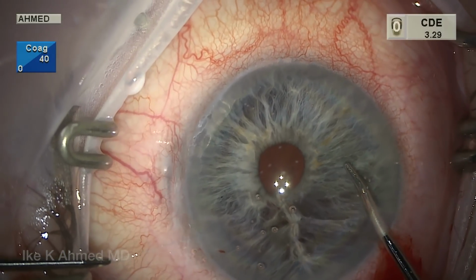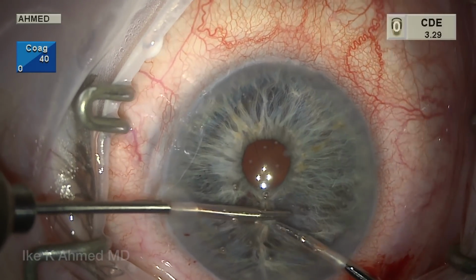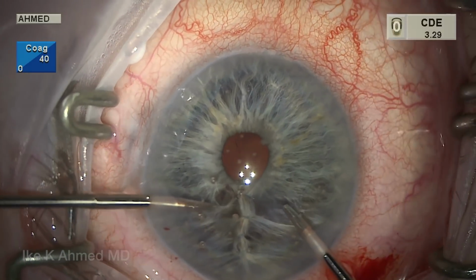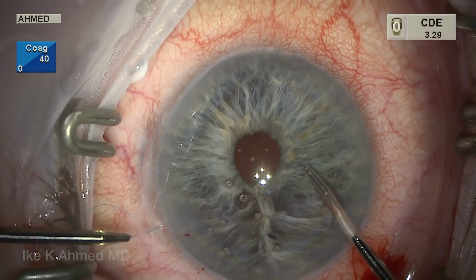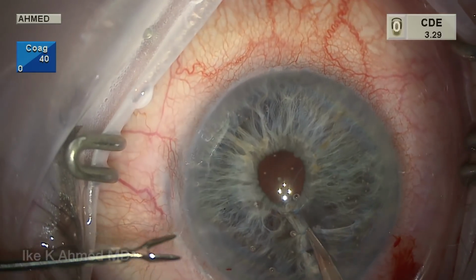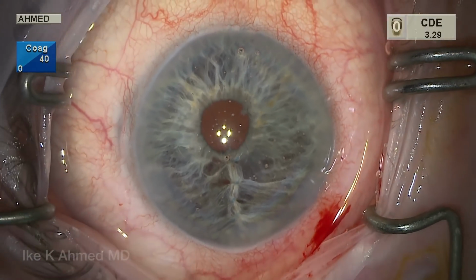At the conclusion of the case, after the suture has been cut, we see a well-formed pupil. We have the iris defect closed, minimizing the transillumination that may be present by over-suturing a little bit and ensuring we have large suture bites. The cosmetic, functional, and visual appearance here is improved with the direct closure using multiple techniques to suture the iris, as well as the tiny knots on the iris surface.